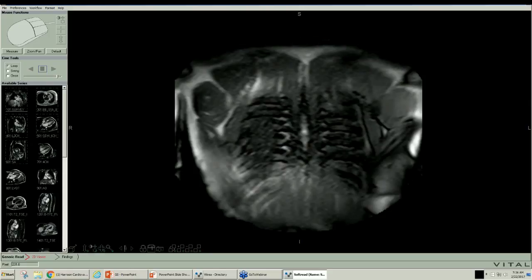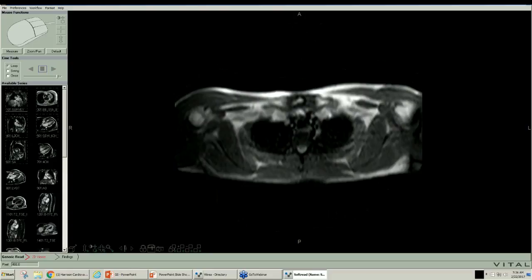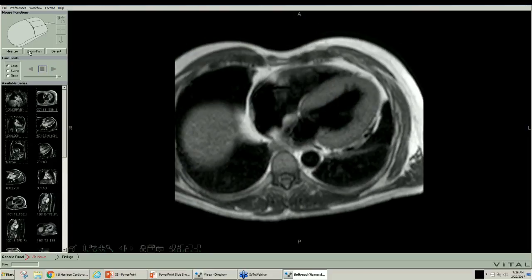Looks like the heart we know well on this patient, recognized by how it's muscle bound. Black blood study, nice for measuring. Over here, there's your septum. 19, consistent with the echo. Posterior wall, 22. Go up here and measure a little bit. 23. So we got a thickened left ventricle, as you know.